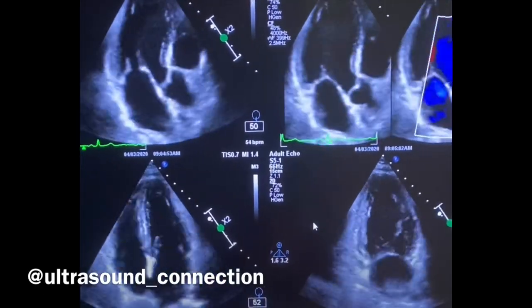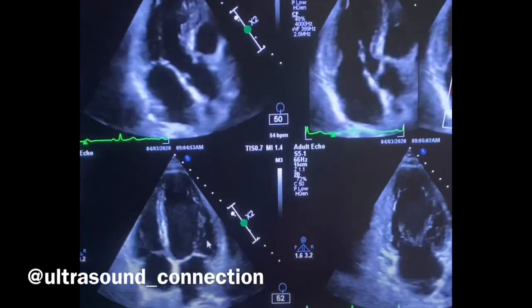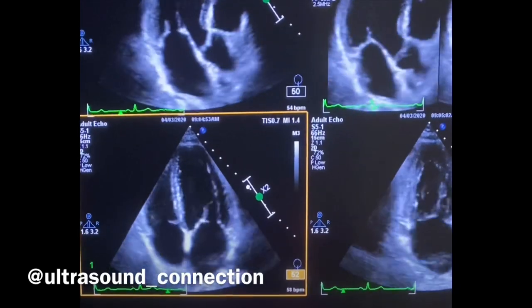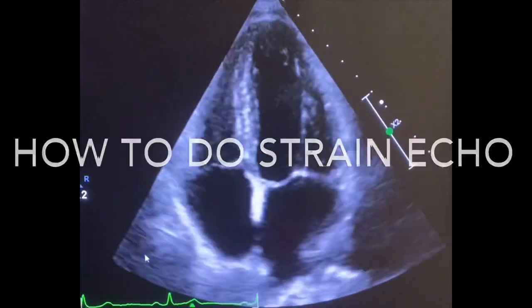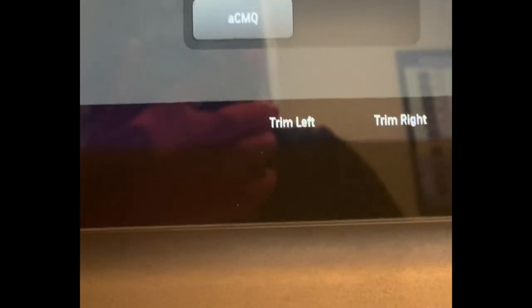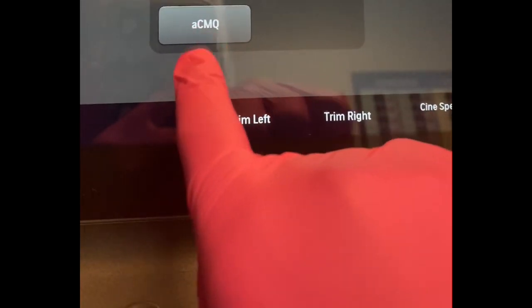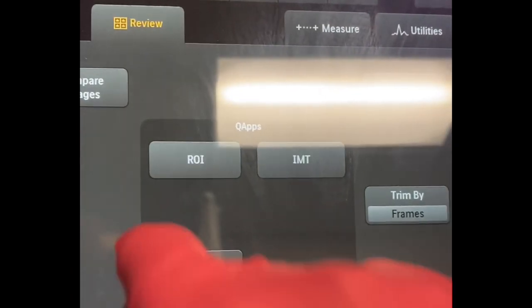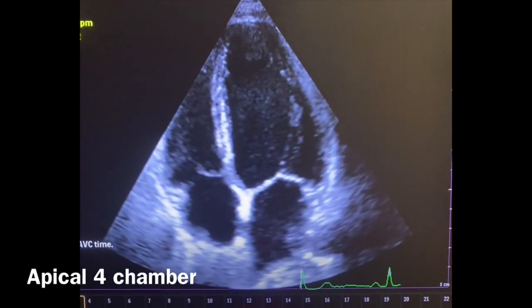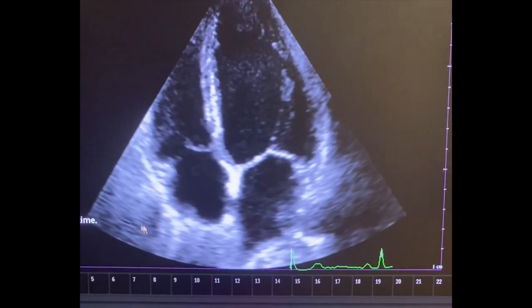Apical 4 Chamber and Apical 2 Chamber view. We're first going to start by selecting ACMQ, which is going to bring up this screen and your apical 4 view.